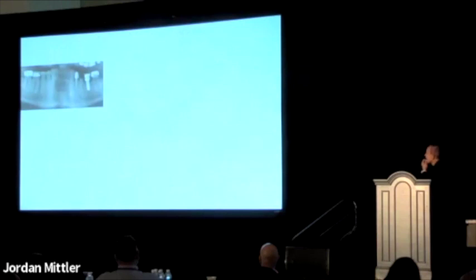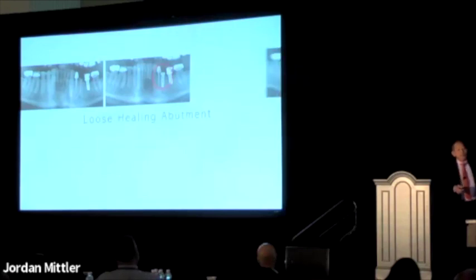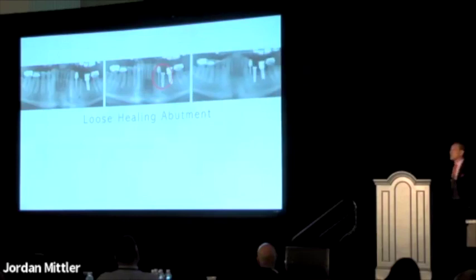Interesting. Very interesting. So here is an example of such. I've done this many times. I take off a tooth, I place an implant, and I screw down the abutment, and it's tight. And I think it's in, but it's not. The eye can see 100 microns. If you can see a gap, that's at least 100 microns. Well, you can definitely see a gap that's open. Well, I didn't know that. I took an x-ray, but I didn't see it. Normally, my girls know to tell me, hey, you're not seated. But I didn't see it. And of course, that immediately results in bacteria and bone loss.